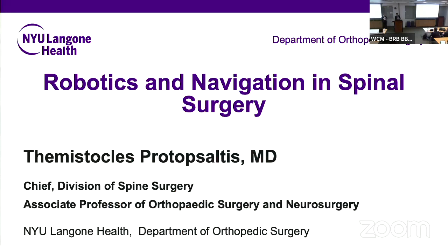And C2, it's always going to be moving with you, right? So even if you're putting a little too much pressure, you're going to be able to hit the pedicles because the reference is moving with you. And then the occiput, you generally don't need as much navigation. It's not as important, but that's what I like to do. And I like to do that separately from the cervicothoracic junction. If I'm going down that far, there's just too much movement in the cervical spine.